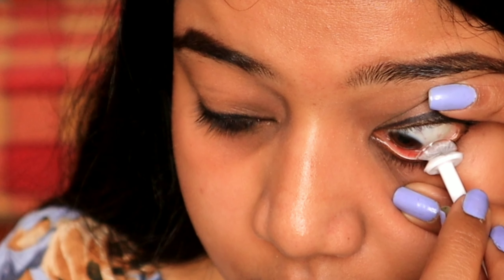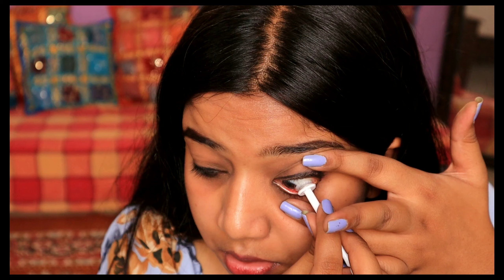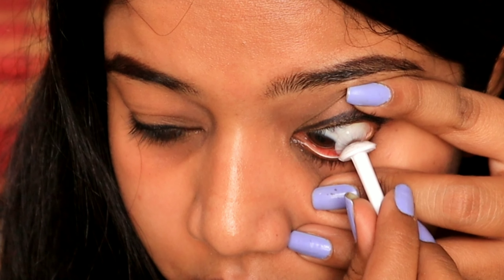Now I'll be applying it to the other eye with the same process — I'm just going to stretch it, keep the lens on the white portion, and move the eyeball. I'm getting pro at this! Let's see — oh my god, I'm getting pro at this!